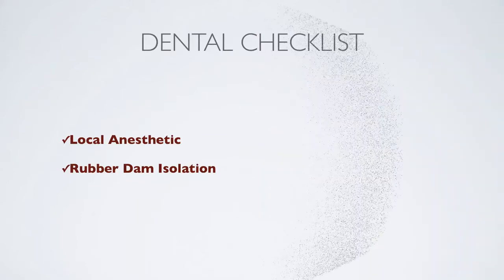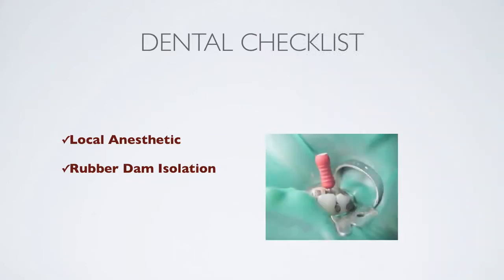Before initiating treatment, I always start with single tooth isolation of the tooth undergoing root canal therapy. This will decrease contamination while making us more efficient and the case more successful. You can see we use a stepwise protocol before actually initiating treatment, this allows for a smooth transition into accessing the tooth.